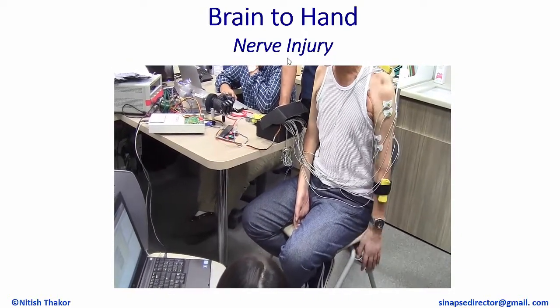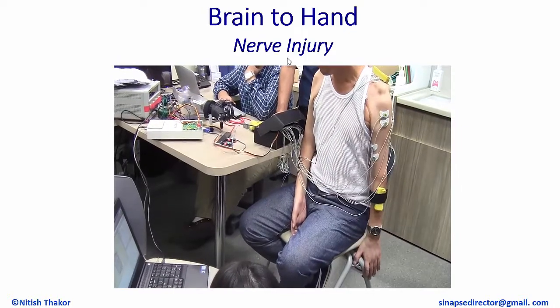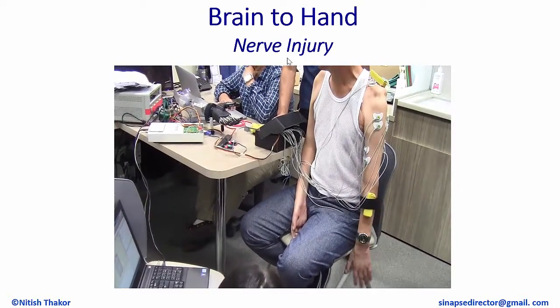If you see a little bit on the table, there's a robotic hand that we can open and close, picking up some of the signals on that. But this person has an intact limb, but not motor or sensory control. So what if we gave that? This is a very large number of people. And if we can figure out how to connect to the nerves using this E-skin and all of that, they would have a better life.